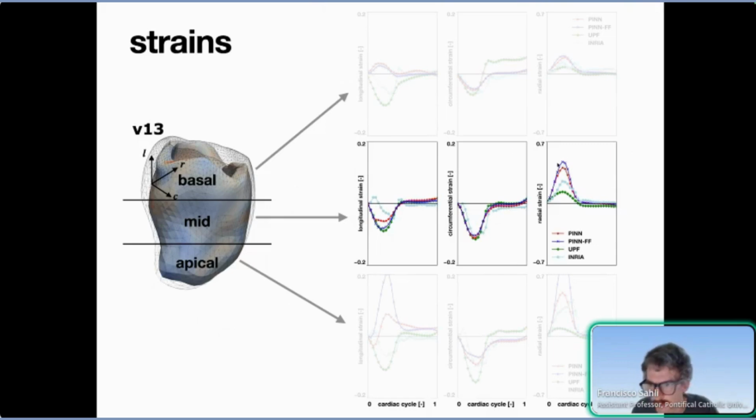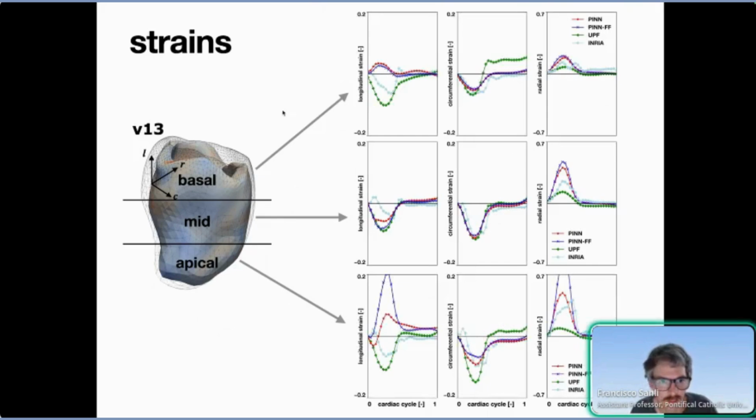Typically the hardest part is to capture this high radial strain, and we can get higher values than the other two methods. But the basal and apical regions are actually pretty hard to capture. The basal plane tends to disappear when the heart is contracting because it moves down, and other structures like the valves appear, which really confuses the algorithm. In the apex region, we don't have much information, and sometimes the apex disappears from the images.